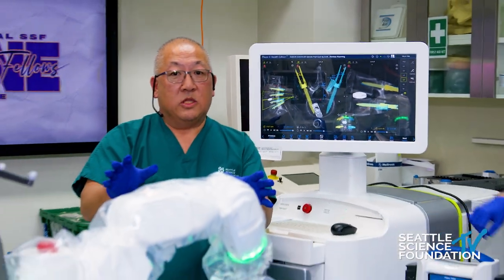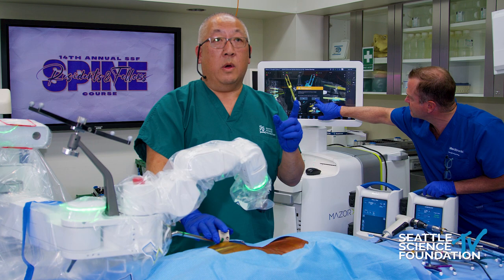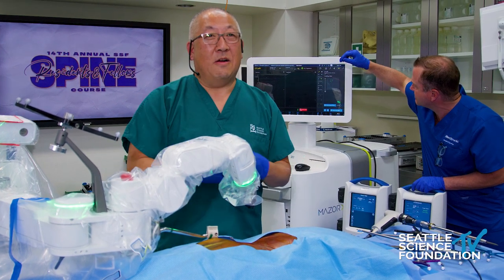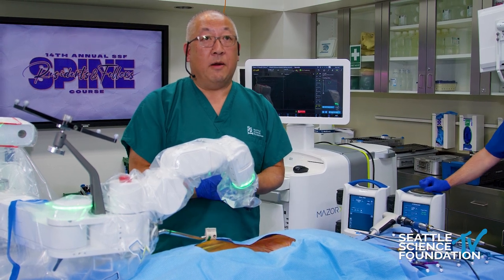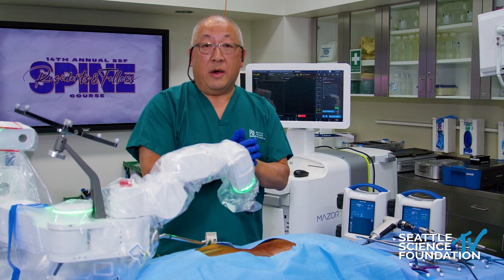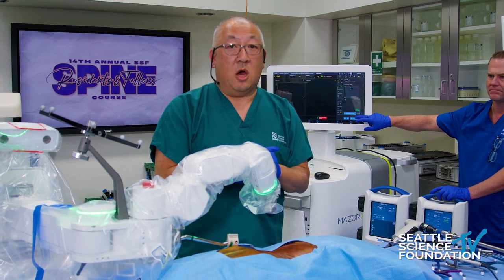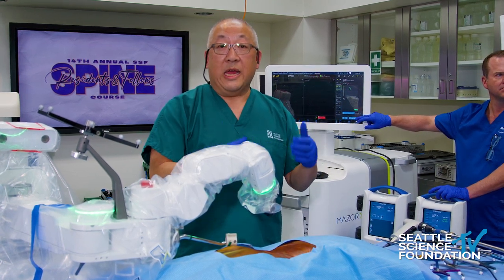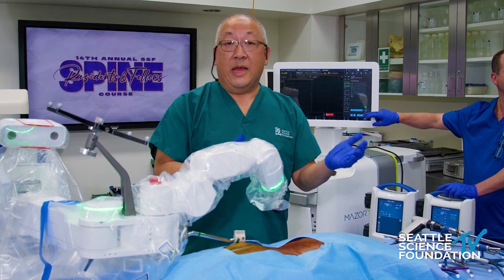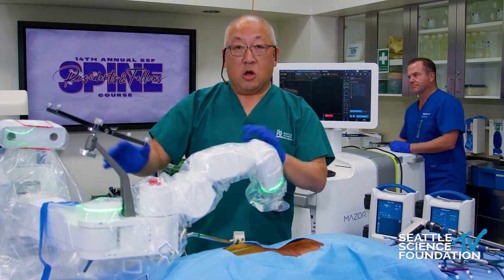We're going to demo how it's done. We have the robotic arm set up — it's table mounted. When it's table mounted and mounted to the patient with one point of fixation, everything is very stable. You don't need to do push-ups or pull-ups on this robot — it's a very stable construct because it's attached to the operating room table. The robotic arm now serves as the reference array for the image guidance. This robot is a fully independent robot with a navigation system embedded into it. If by chance the navigation goes bad and you can't reconcile it, you can use this robot with one millimeter accuracy without a problem — the Mazor was fully functional with one millimeter accuracy even before navigation was installed.